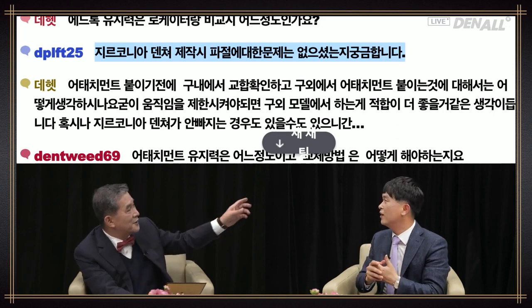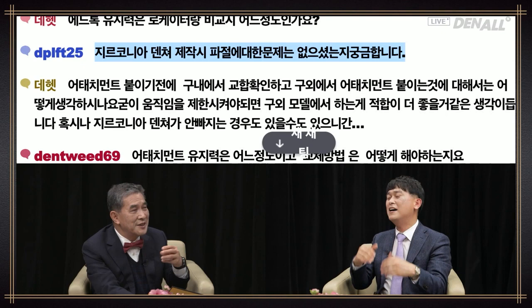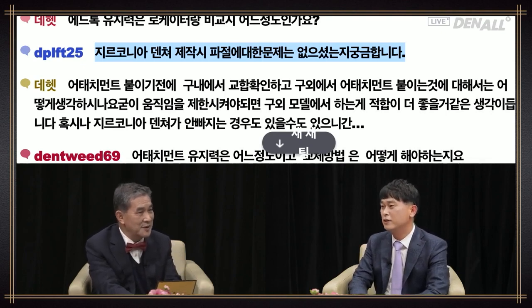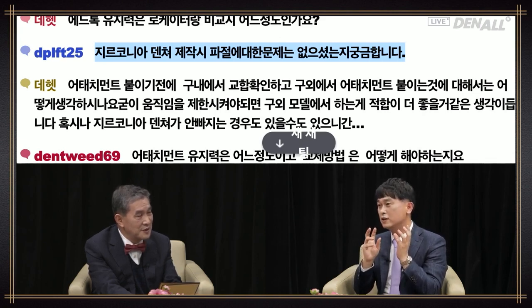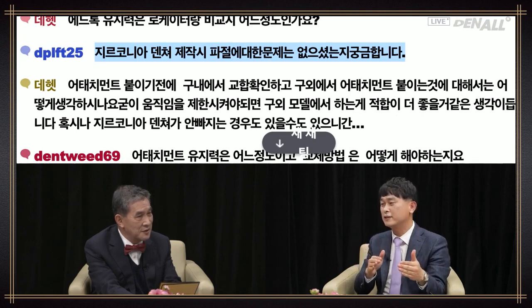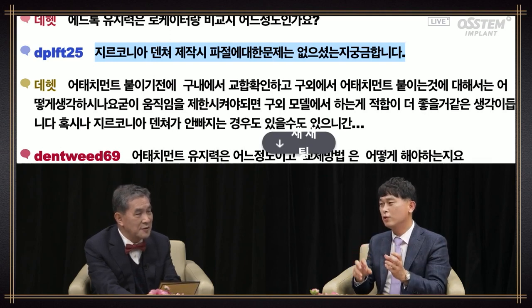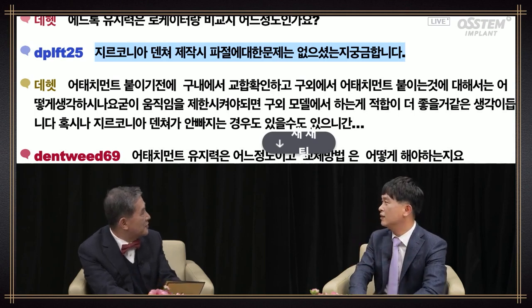I think the question is if it is fabricated and it is broken while pulling it out, can you repair it? No, you have to make it again. It's just like the fixed prosthesis. We use monolithic zirconia, and if it breaks, we have to make it again. We have to get rid of the fixed concept of denture. A denture has movement and should be relined, so resin is used for that. And zirconia is held by the bar.